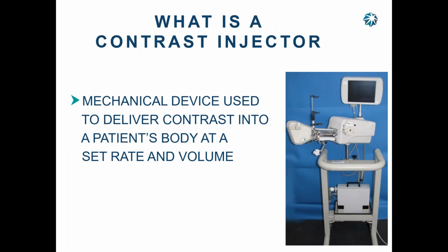So what is a contrast injector? And you can read it if you want to. It's mechanical, right? It's a mechanical device used to inject contrast into the body through an IV. What are the advantages of a mechanical device compared to the syringe? Specific dose.